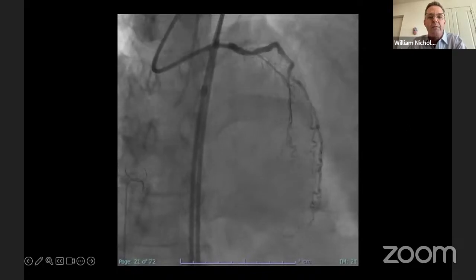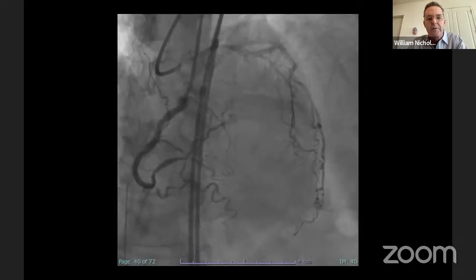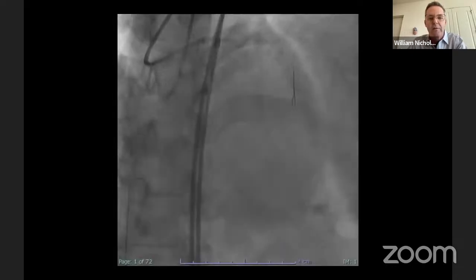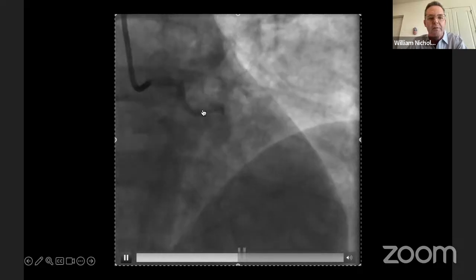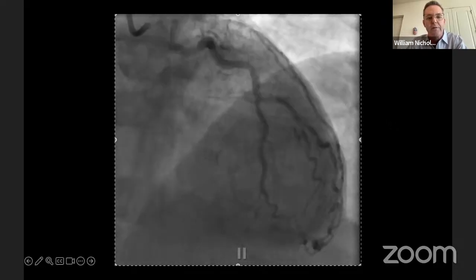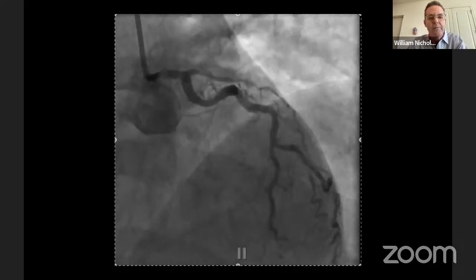Rinfret, for a live case, and it's an interesting, challenging case. I'm curious, what would your starting point be? I suspect, and I don't want to put words into your mouth, that you would probably think about an antegrade IVUS-guided cap puncture to start here, Dr. Pan, or would you think about retrograde from the beginning, knowing that you have a couple of really challenging scenarios coming your way, either way that you go?